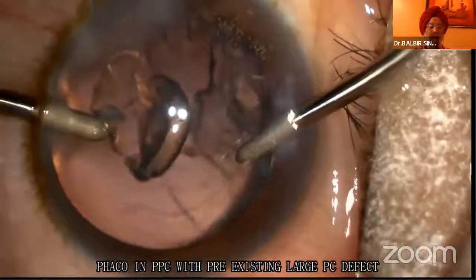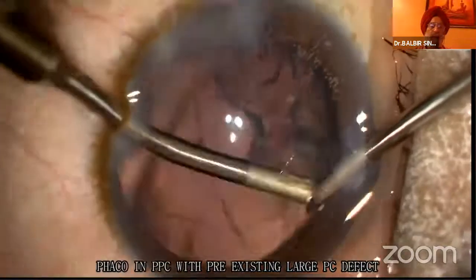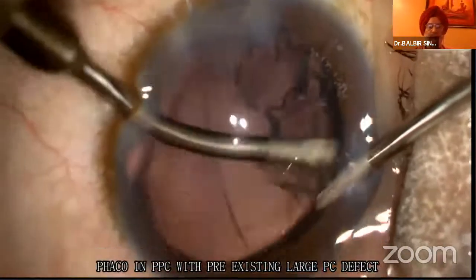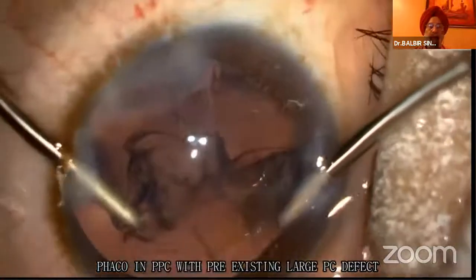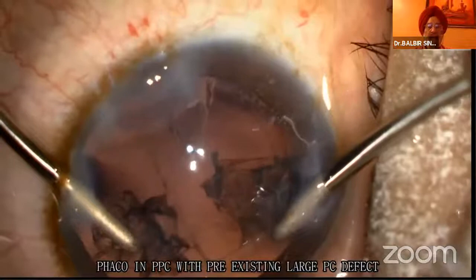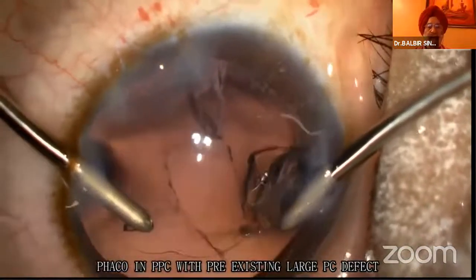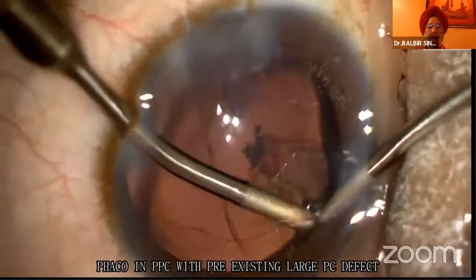So you can see the tear which I pre-operatively marked by arrows. It corresponds to the post-operative tear. You can see it from end to end, from limbus to limbus, a big tear, which I again repeat, I had 2 cases, similar tears, similar situation, similar surgery.